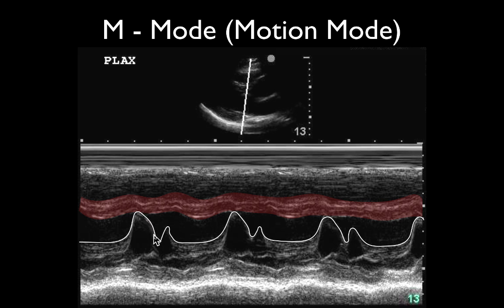As it relaxes, it comes down, and then we hit the active phase of diastole and get a little more blood coming in. So that mitral valve flips open a little bit more, then relaxes, comes down, and it's closed. Then it goes through that same process — relaxes, flips up, lets all the blood in, slaps against that wall. This is a pretty normal-looking mitral valve as far as its motion compared to the septal wall. It's got good movement, it's likely not stenotic, and the patient probably has a decent EF based off that endpoint septal separation.